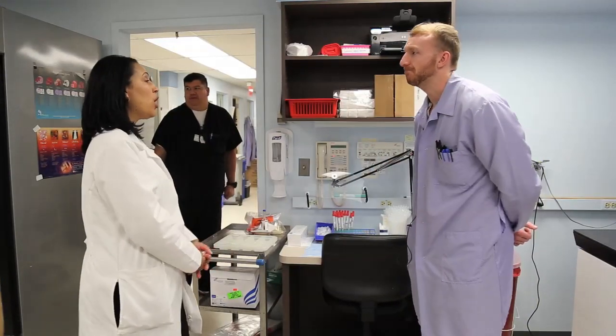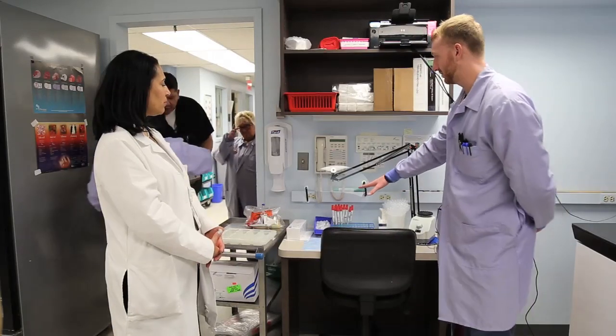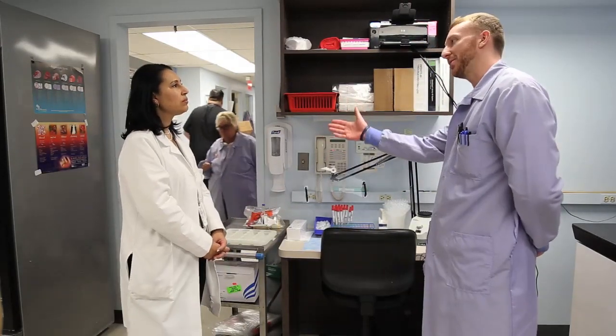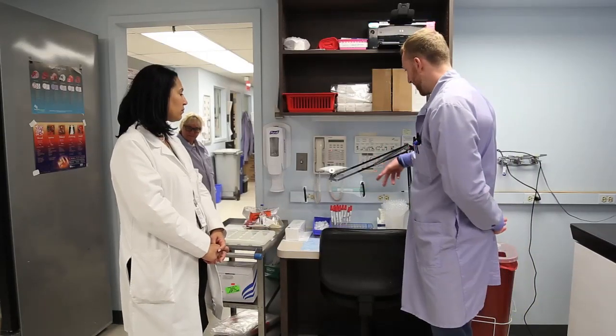So you do this on what specimens? The highest volume test is the MRSA swab, which is the red top swab here that all inpatients will get. Or I guess now it's been changed so there's an algorithm and only some patients get it. So that's just a swab of the nares. It comes in 2 swabs.